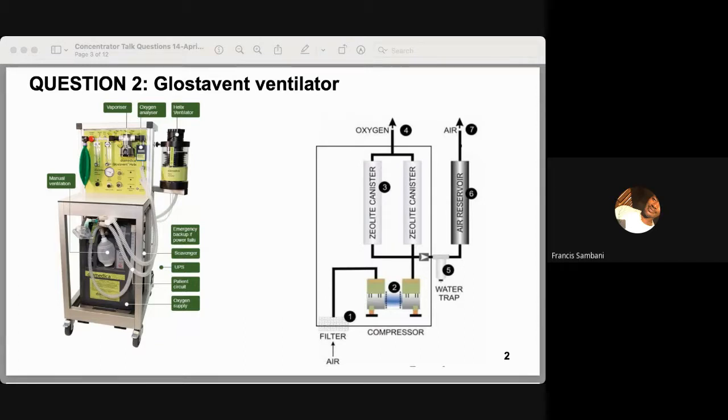So a trained anesthetist can increase the oxygen flow if higher levels of oxygen saturation are required. The anesthetist should know the amount of oxygen needed for a patient and the flows for air and oxygen to be blended. If he sees that more oxygen is needed for the patient, let's say maybe greater than 82%, then I recommend a separate source of medical air be provided for such a procedure. Just make sure that the separate source of air is filtered as well as regulated to the recommended pressure before being blended in with the oxygen.